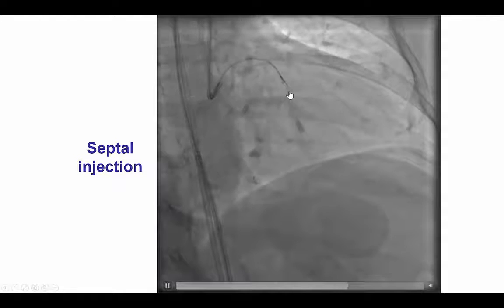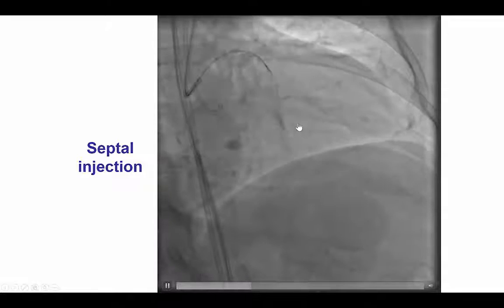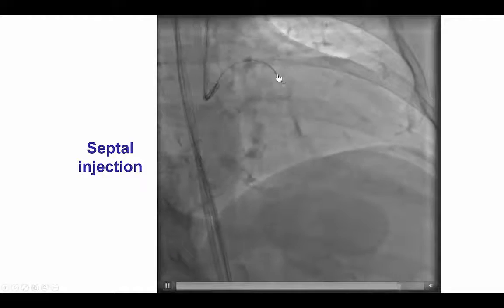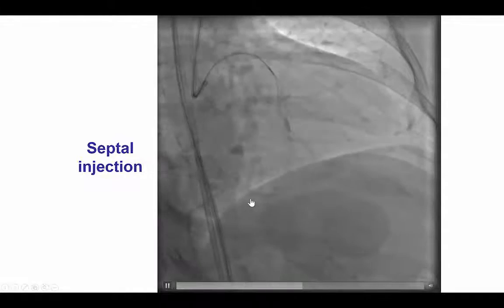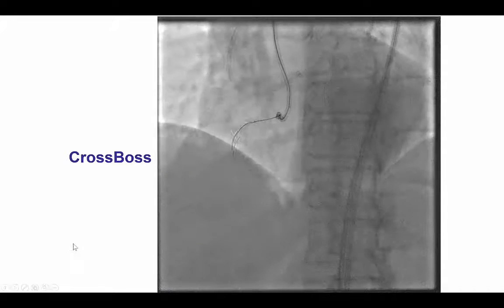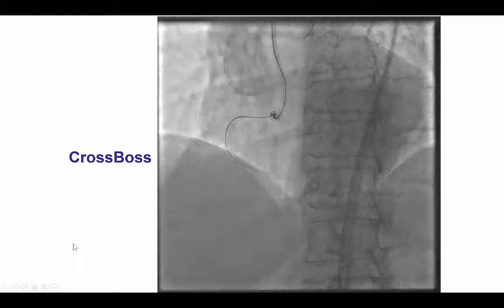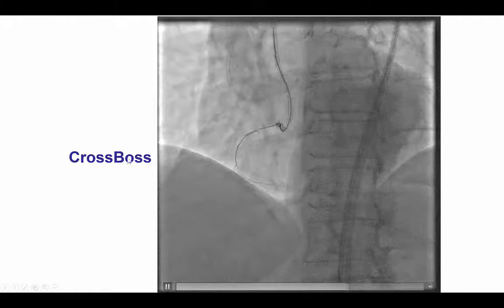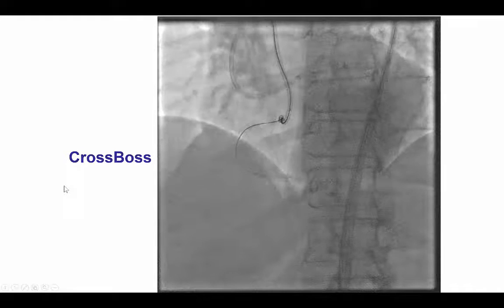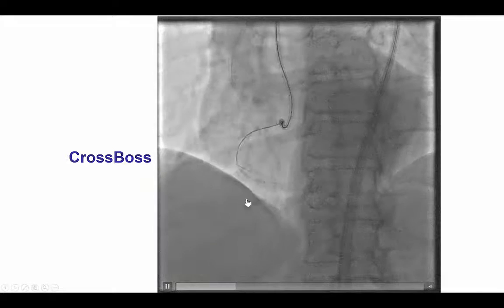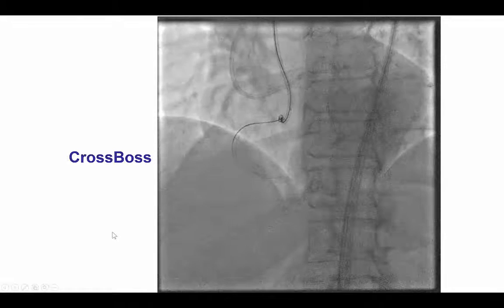We first tried to go retrograde, but unfortunately we were not able to make a connection between the LAD, the septum, and the PDA. Therefore, we switched to antegrade dissection reentry and were actually able to advance relatively easily a Crossboss catheter past the mid-RCA all the way to the distal right coronary artery.